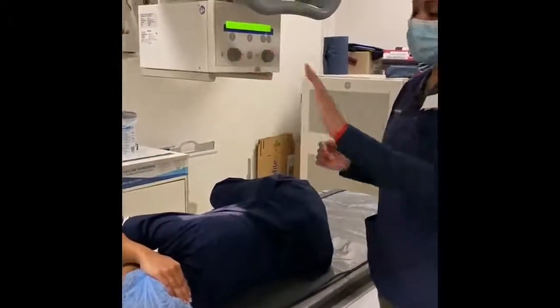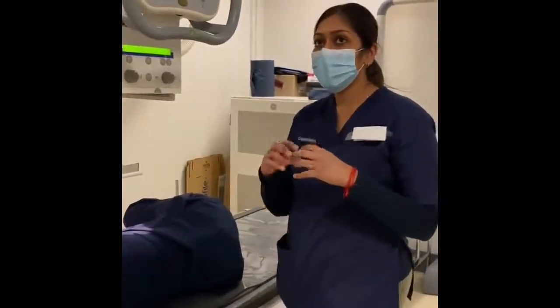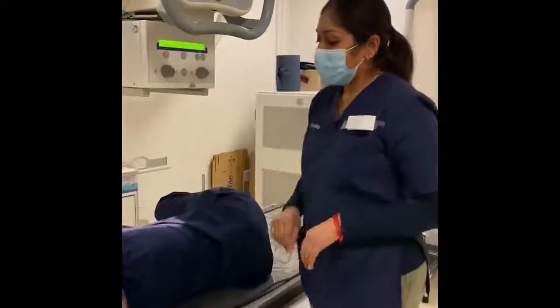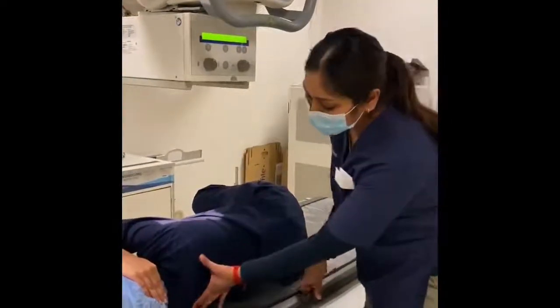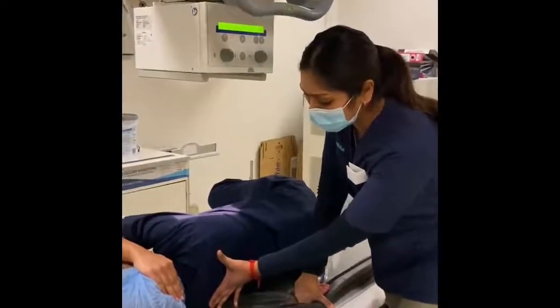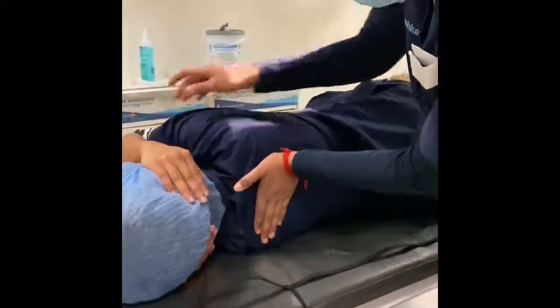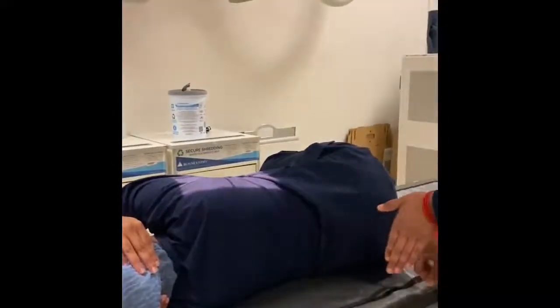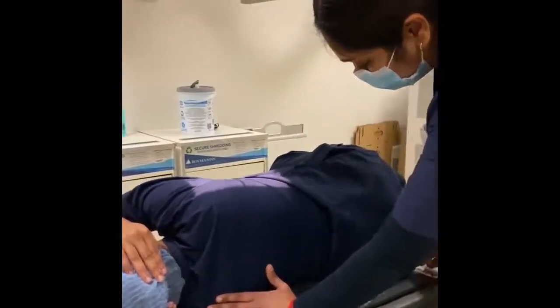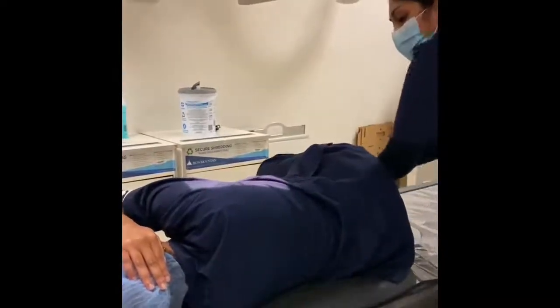Okay. Remember to be very gentle with your patients, and also take note of where you're touching your patients. That's very important. Okay, so more or less with the posterior part, we want the shoulders to be nicely aligned so that there's no rotation. So I just make sure that area is nice and straight. And then can I ask you just to push your lower back slightly forward for me? Okay. Like this part, yeah? So just to lift that way.